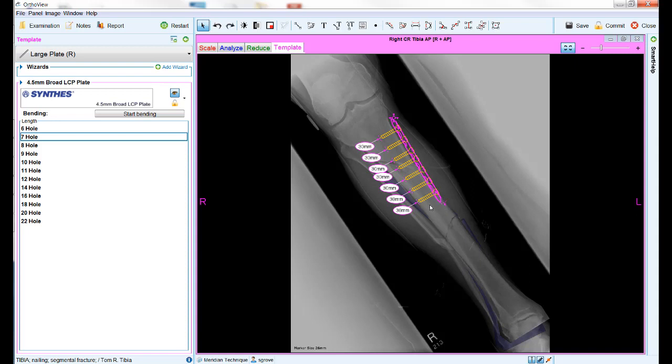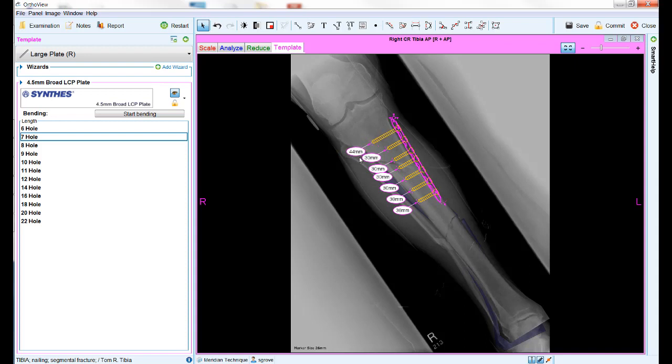Where available, the plates and screws are pre-populated with applicable screw types as designated by the manufacturer. These screws can be adjusted for size, position, and type. To resize a screw, left click and drag on the end of the screw. The screw length can be dragged through a preset range of sizes determined by the manufacturer. Depending on the type of screw, locking or non-locking, the angle of the screw may also be altered at the same time.